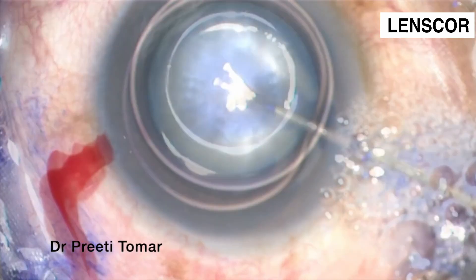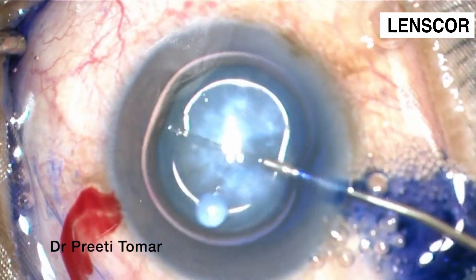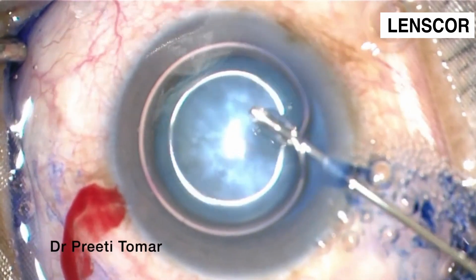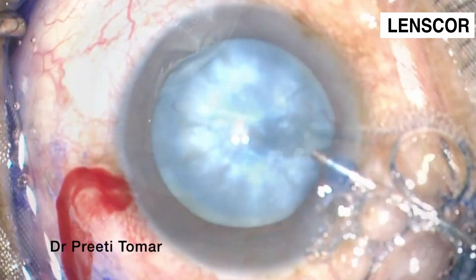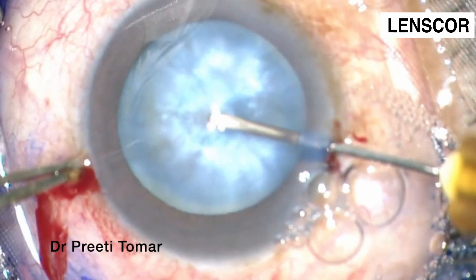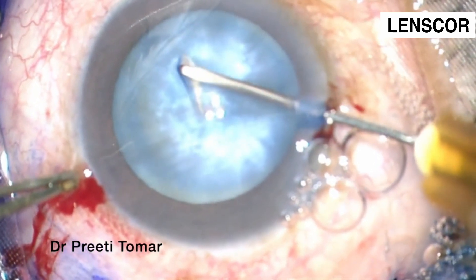Hello everyone, today we are going to learn the basics of FACO — the stop and chop technique. This technique also serves as a stepping stone for your future FACO chops. Before initiating your capsulorrhexis, you must pressurize and maintain your anterior chamber with cohesive viscoelastics.